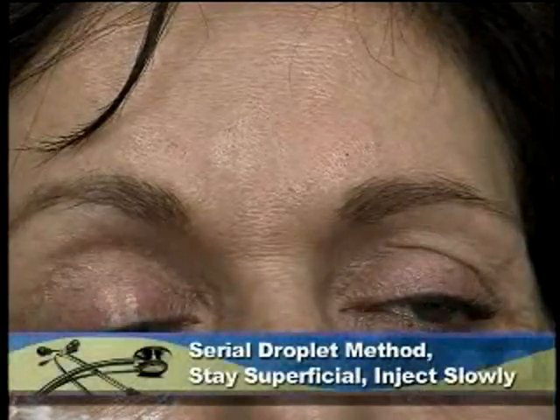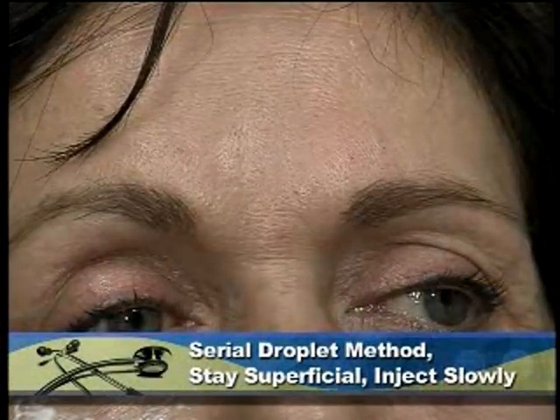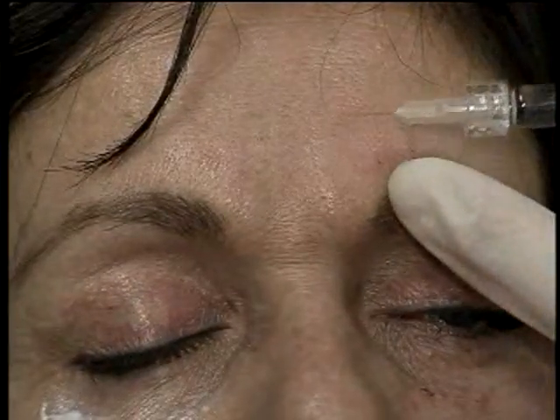If you do it in this area, you have to be careful. There've been reports of necrosis with both collagen and fat in this region. Therefore, I'm very careful when I inject filler into this area. I use a serial droplet method. I stay superficial and I inject slowly. And I think that's the important part. If you go too deep, theoretically, you can obstruct an end artery and cause necrosis of skin. So we do stay superficial and we deposit slowly.